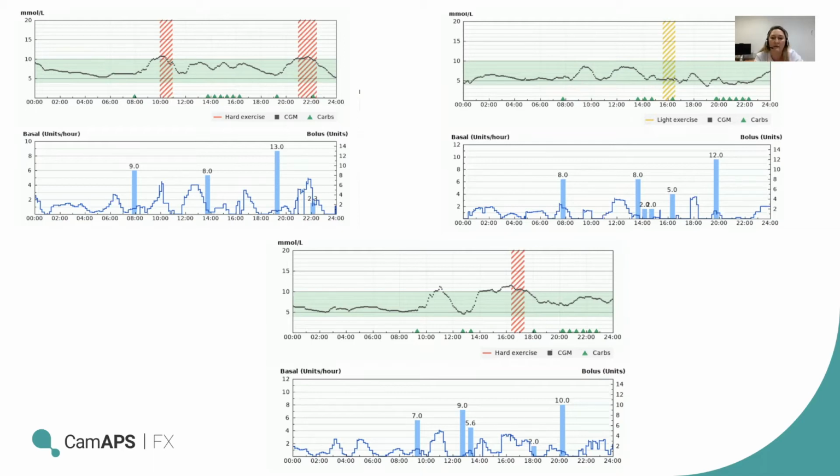or the algorithm driven. And you can see really nicely in this example in the top right, where the bolus of 12 units has gone in up front, and actually the system hasn't really needed to give anything much extra for the slowly absorbed meal, and it's probably actually dealt with it later on. Maybe that was something that was much more slowly absorbed potentially. And again, another really nice example there where someone's had 10 units up front for their evening meal, and then the algorithm's given those additional pulses that are incorporated into the algorithm driven insulin that you can see below to again keep the glucose nicely in target. So there's some examples of it in action.